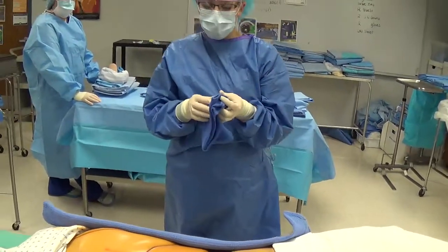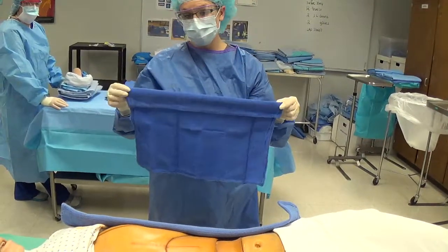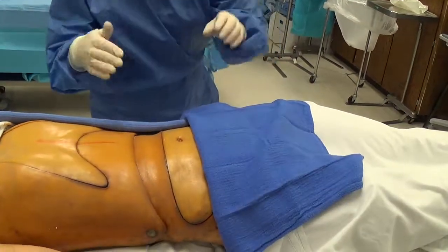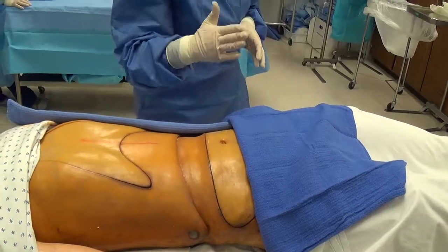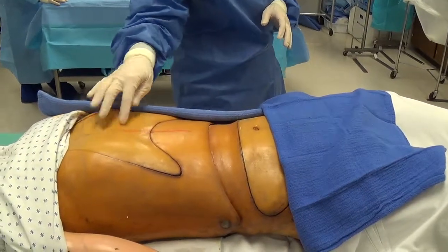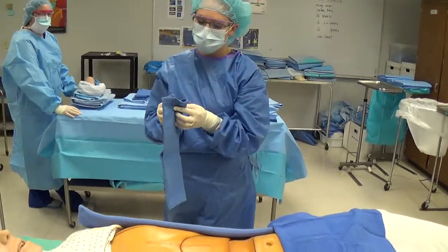Then we place either the top or the bottom towel. Open the towel, make the fold away from you, and swing out making sure you occlude any unsterile things showing near the incision — covering the linen, the patient's gown, or anything else. They cannot be showing on the side where we are making the incision; they must be isolated from the incisional area.